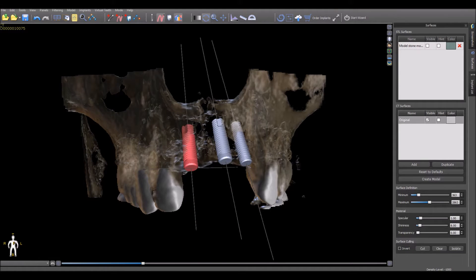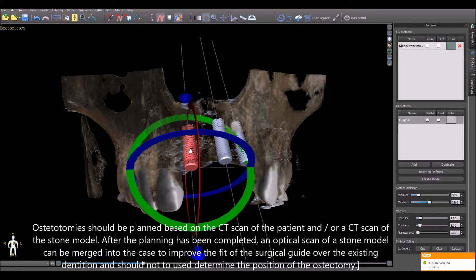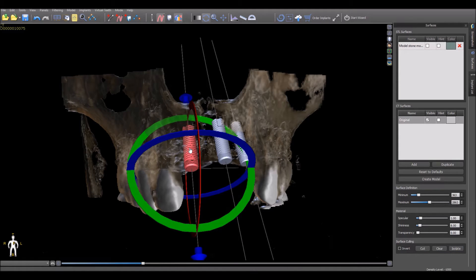The arrow keys on the keyboard can be used to manipulate the implant, virtual tooth, or model almost on a pixel-by-pixel level. Click on the relevant item and simply use the arrows on the keyboard to move the item in any direction. To rotate, press Alt and again use the arrows to rotate the relevant item.